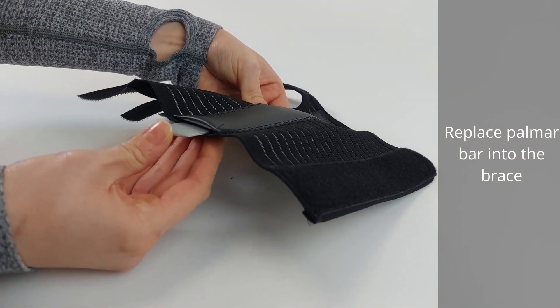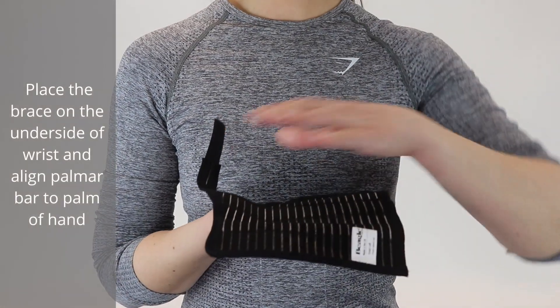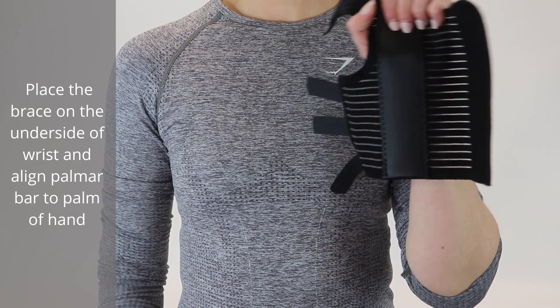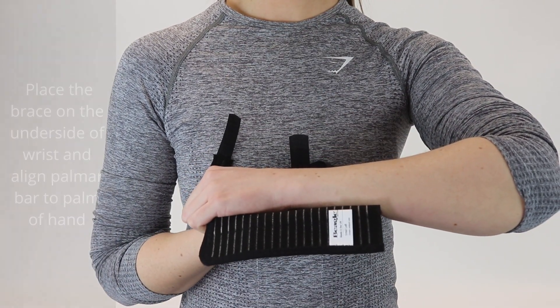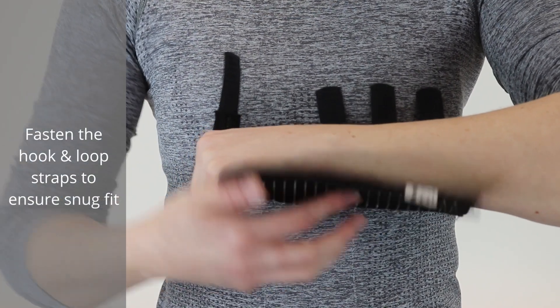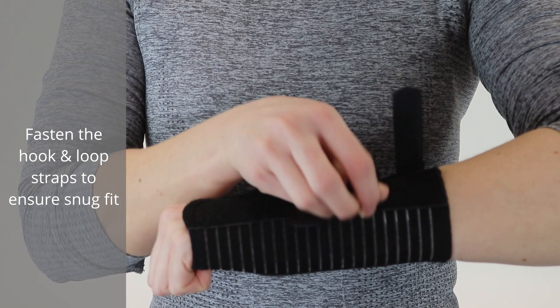Replace the palmer bar into the brace. Place the brace on the underside of the wrist and align the palmer bar to the palm of the hand. Fasten the hook and loop straps to ensure a snug fit.